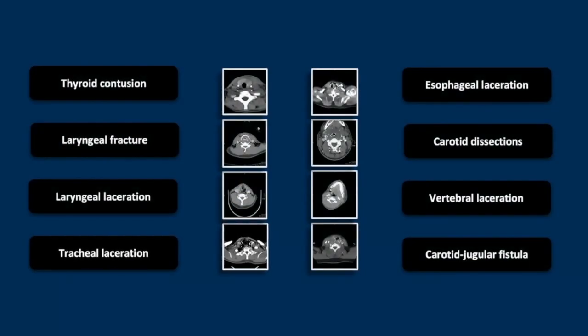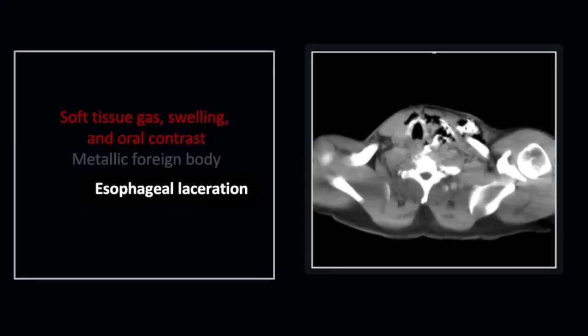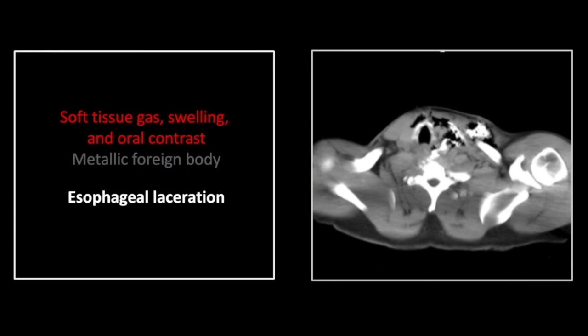Our next case is an esophageal laceration. There is extensive soft tissue gas. Whenever an injury of this type is suspected, a sip of oral contrast is in order, and that's what they did in this particular case. You can see the oral contrast spilling out into the supraclavicular and anterior cervical soft tissues.